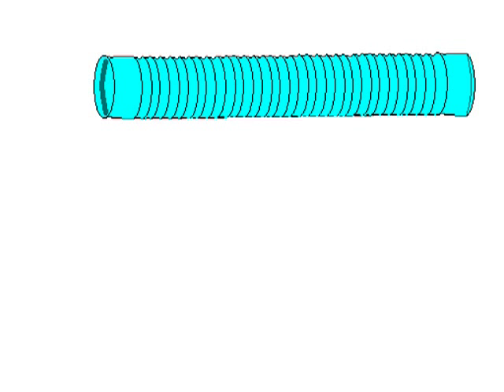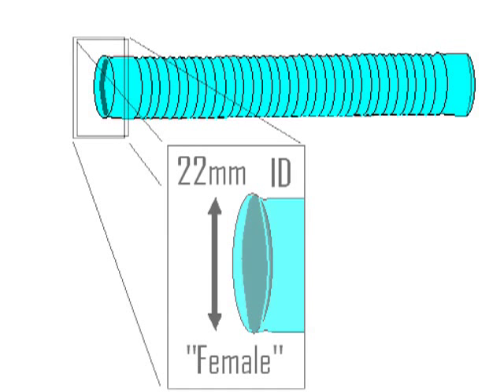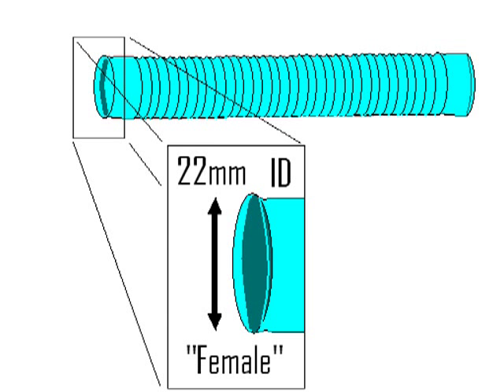Let's start with something we're all very familiar with: blue corrugated tubing. Let's look at the end of it. The end is 22 millimeter ID, internal diameter, which is always known as female. Nothing fits over this — only something fits in it, the male adapter.